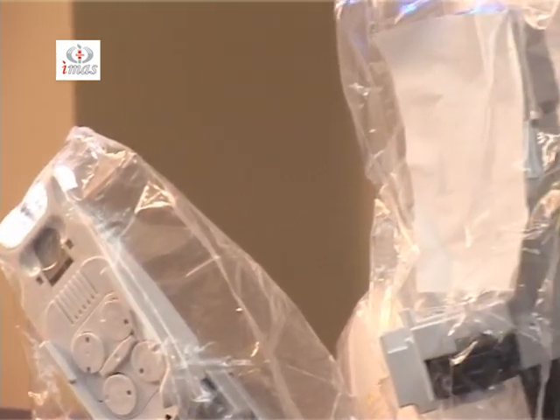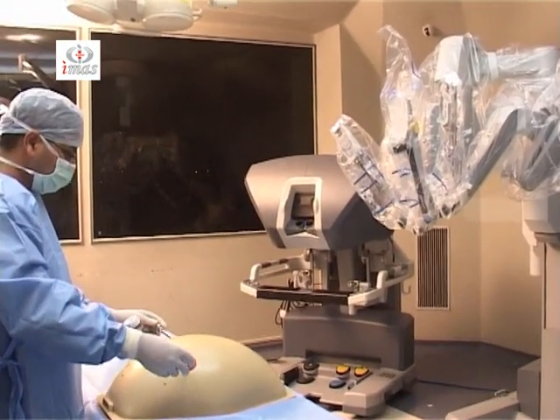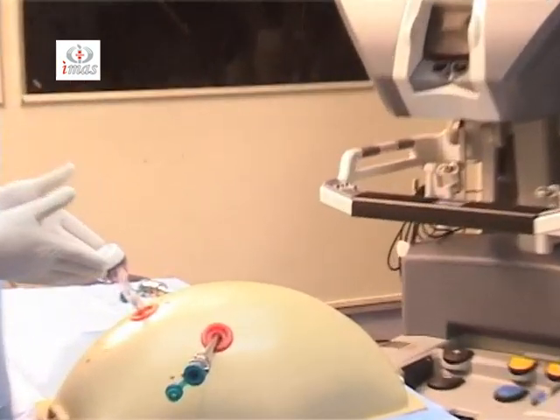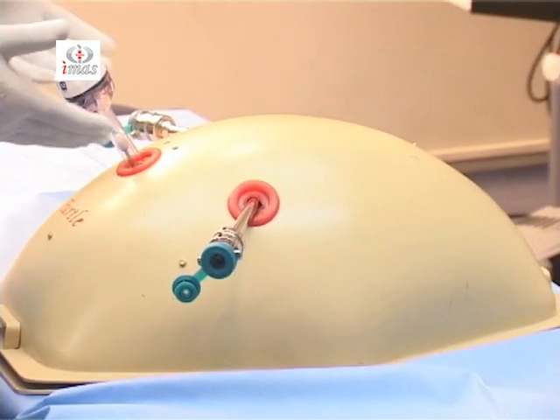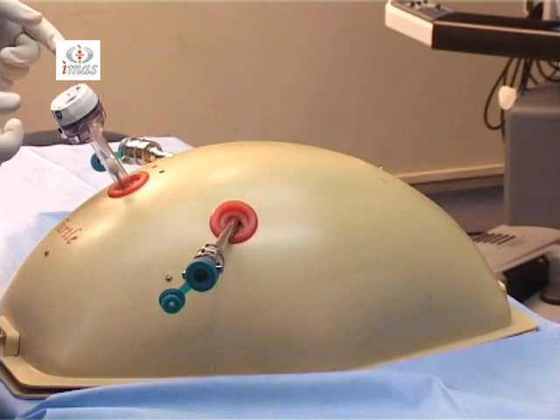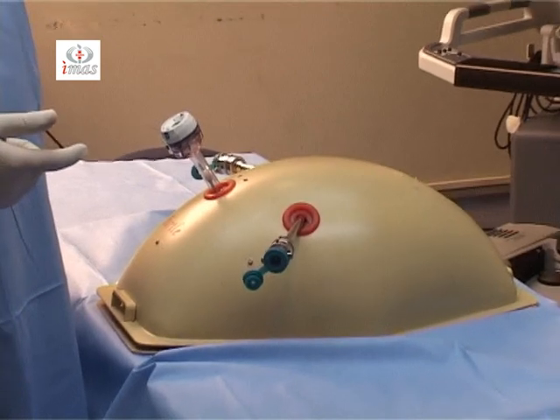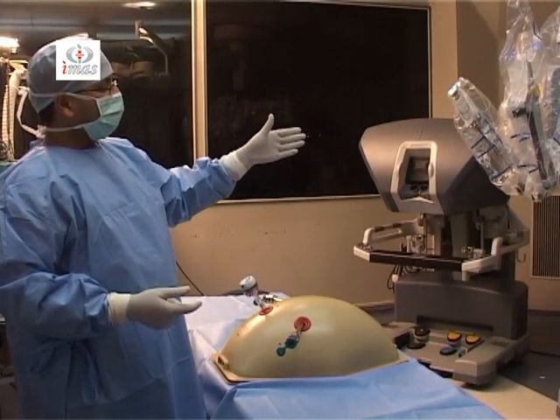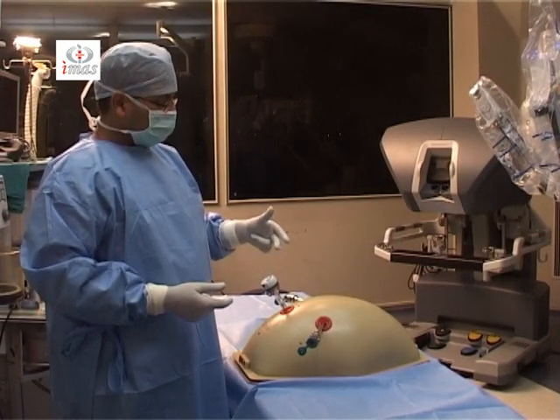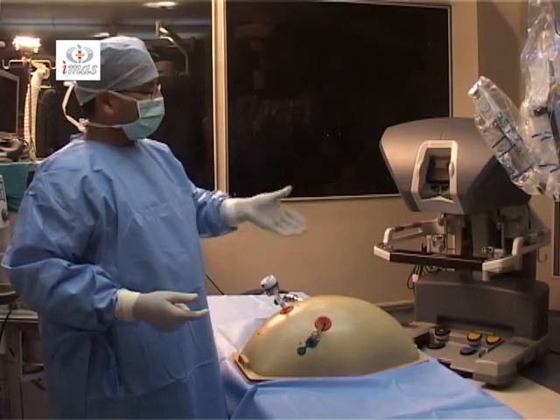I'll insert the ports onto the patient's body. The camera port should be at least 10 centimeters away from R1 and R2 ports, and if they form a triangle, the base of the triangle should face towards the patient cart's center column and the camera arm. That means the camera port, the target anatomy and the patient cart's center column should be in the same straight line.